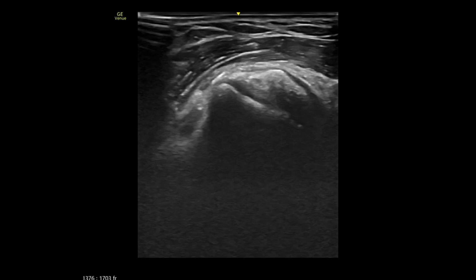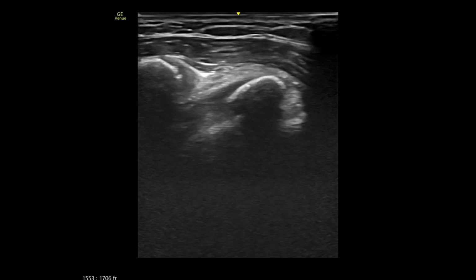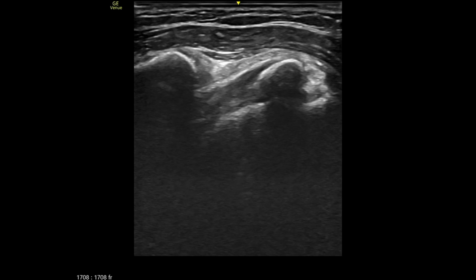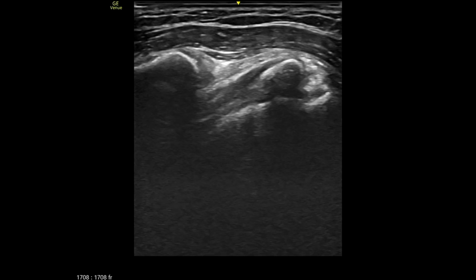Pre-operative ultrasound evaluation. Assessment of calcium deposits. Examine the calcification size, density, and shape. It will help in determining the severity and guide the needle approach. Designing the needle approach pathway. Identify the optimal pathway to reach the calcific deposits with minimal damage to surrounding structures.